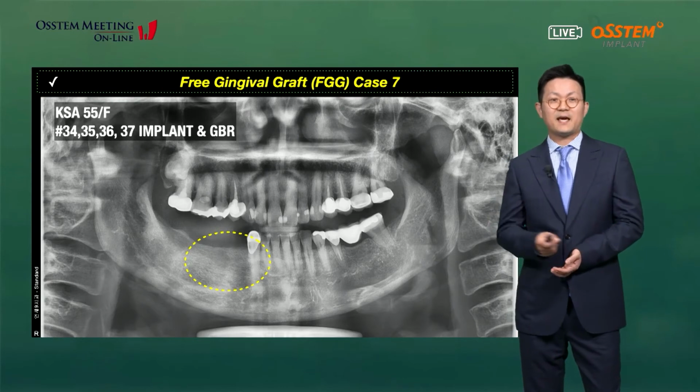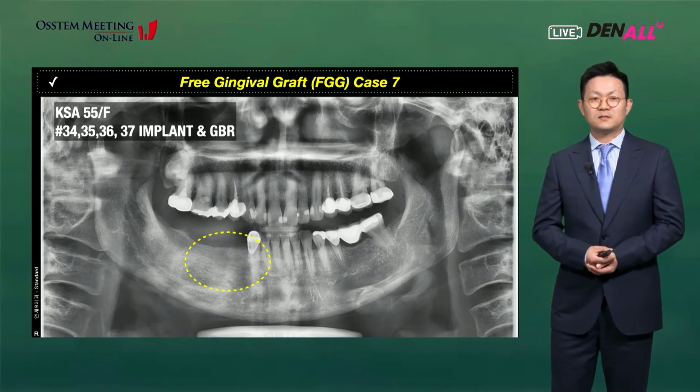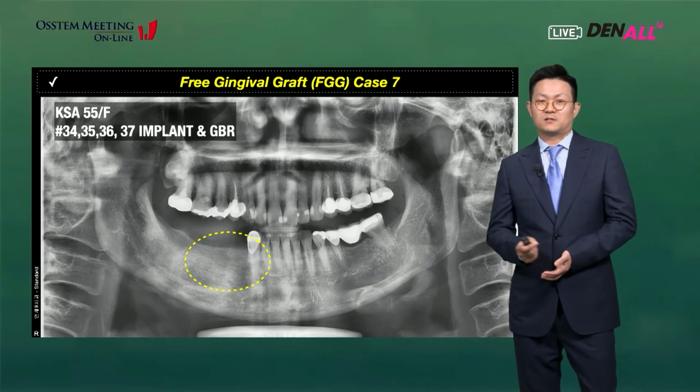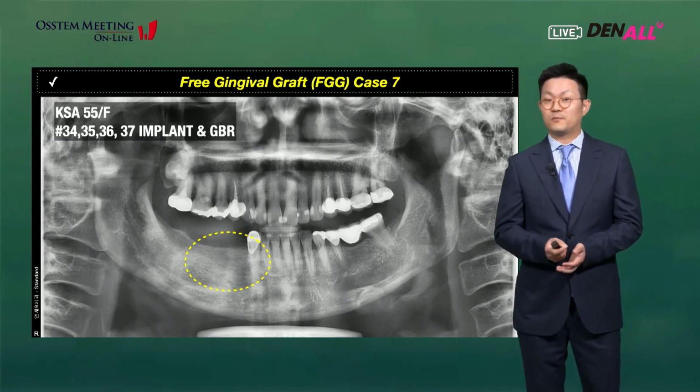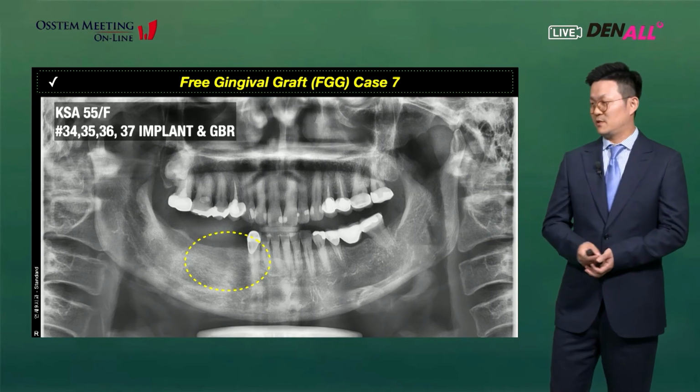This is the last case of today. This 55-year-old female patient has reported to my clinic for implant treatment on the right mandible edentulous area.